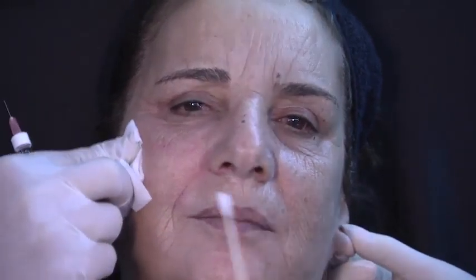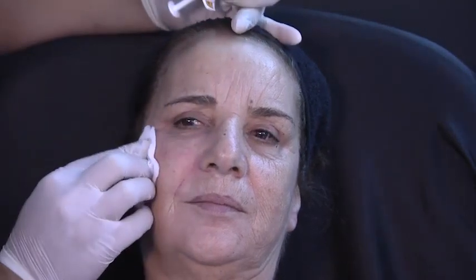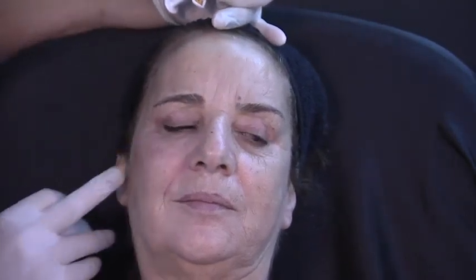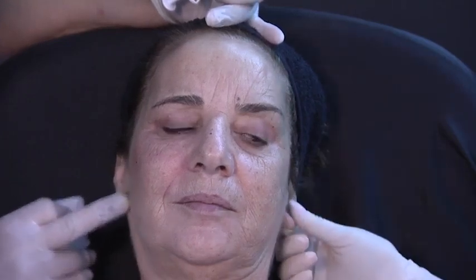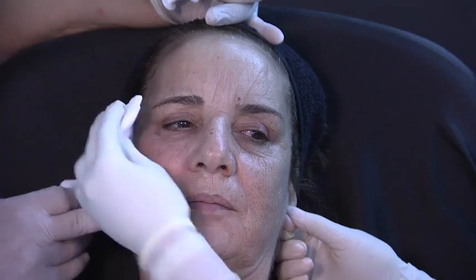Okay, we'll just take one question while you're doing those lines. Sure. Okay, go ahead, please. Thank you for the fantastic injection. My question is, for optimizing the results, would you consider doing a few boluses at the angle of the mandible and somewhere in the periauricular area, somewhere in the parotid area? Right, you have to remember this session is personalizing the mid-face. Well, anyway, I will answer. That's a good question.